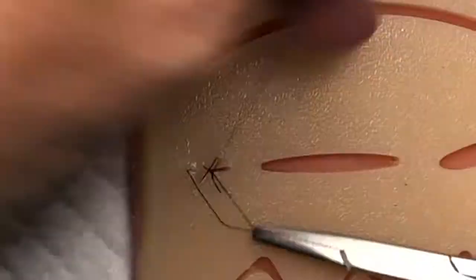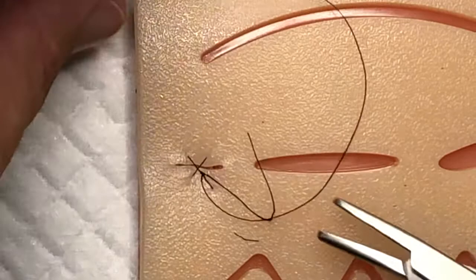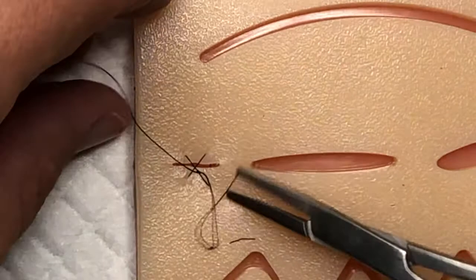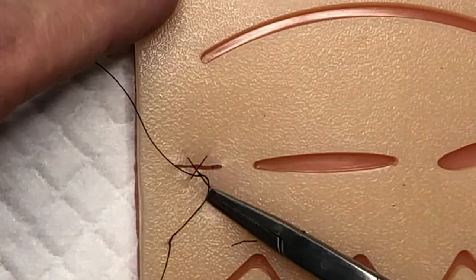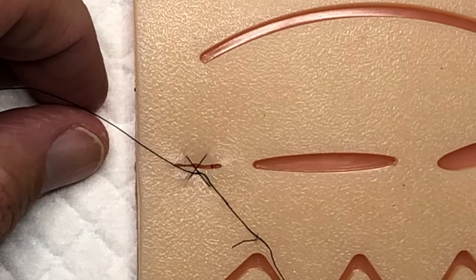We pull it snug. With these silicone kits it's not quite the same as tissue, so the knots may not be able to maintain that tension across. But you can see right here how that does bring the edges together and provides a little bit of tension. On real tissue you can bring that down a little bit tighter and really close that off and stop the bleeding from a little varicose vein, puncture wound, or abrasion.